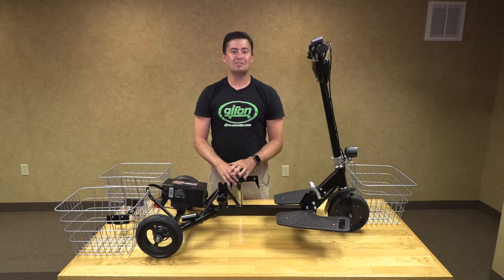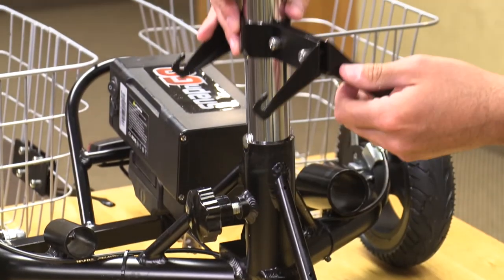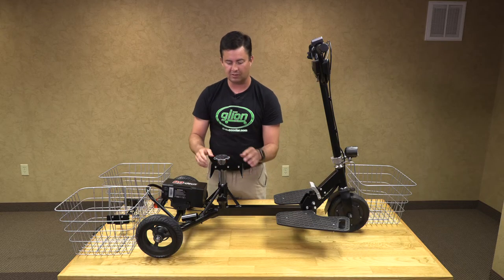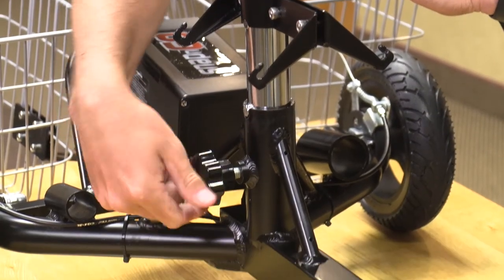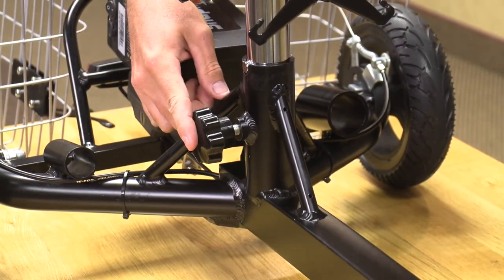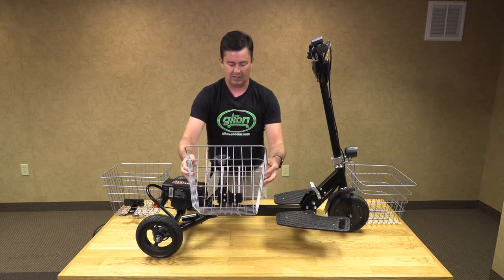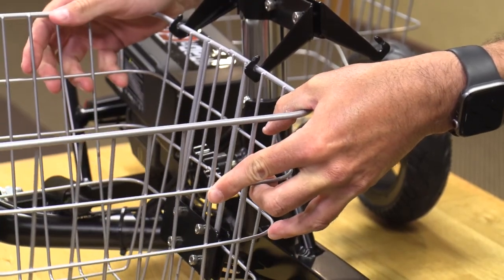Now we are going to install our seat post with the bracket. We are going to lower it onto our Glion Snap and Go, making sure the bracket with two holes is always towards the front. Once you have it in its peg and notch location, you want to make sure you tighten it down so that it will not get in the way of your baskets. Now we will take our basket and slide it on, making sure it goes just past those rubber stops.